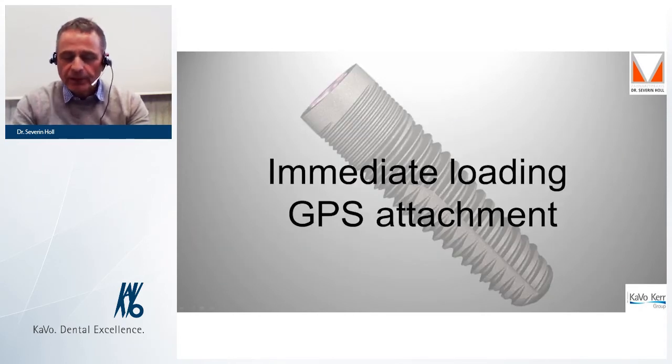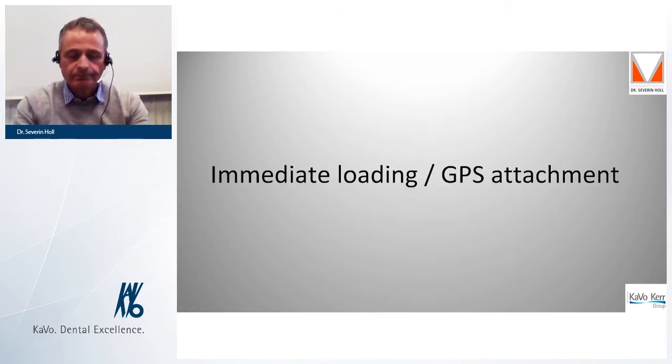Now that we have been dealing with single crowns, we come to a different treatment concept of our practice. The immediate fixation of provisional denture with the GPS anchor. Let us watch a film.